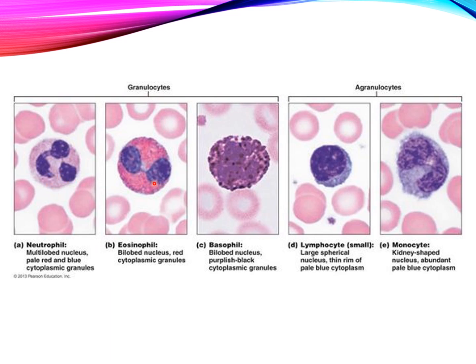Eosinophils have the bilobed nucleus that's staining basophilic, but they have those red granules inside that take up the eosinophilic dyes. The basophil has the basophilic nucleus, and it also has the basophilic granules that tend to look dark blue. And again, you probably will not see many basophils in your lifetime. They're very rare, unless there's some kind of allergic reaction occurring.